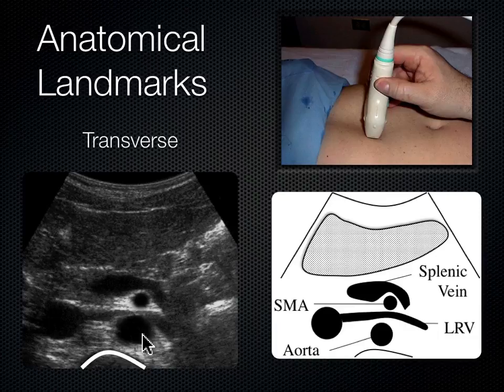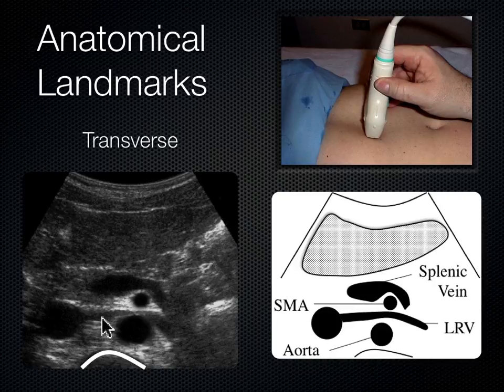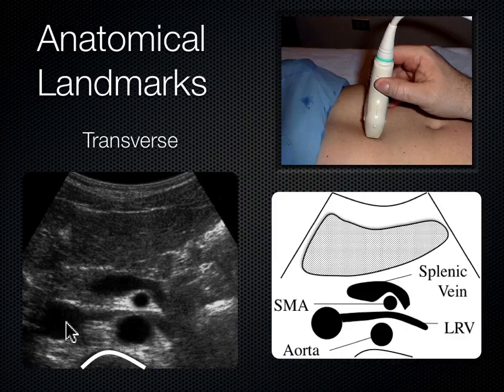Between the aorta and the SMA, there's a blood vessel that gets 'nutcracked' between those two vessels and then drains into the IVC. That vessel is the left renal vein — abbreviated LRV.